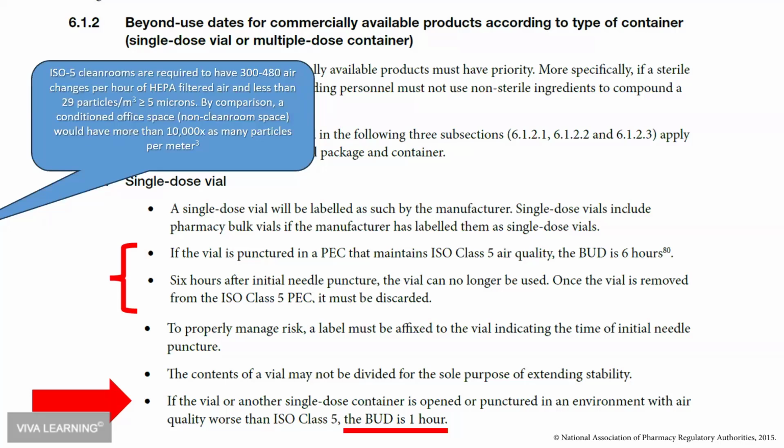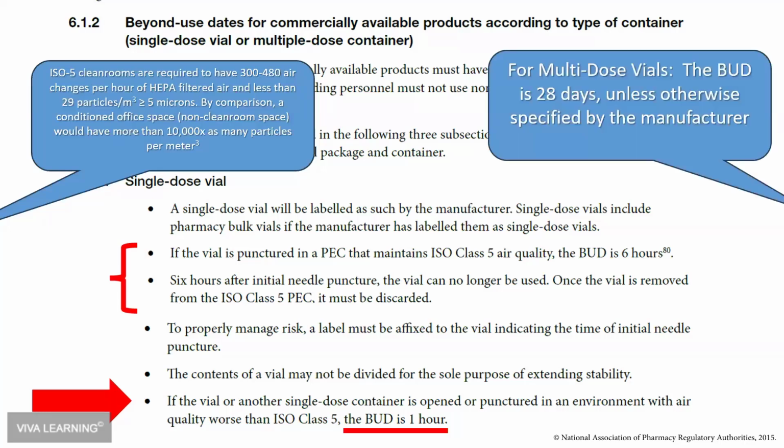If this vial was a multi-dose vial, which it's not, unfortunately, it's a single dose vial, the beyond use date would be 28 days, but it isn't. So again, that's my major concern with chairside buffering.